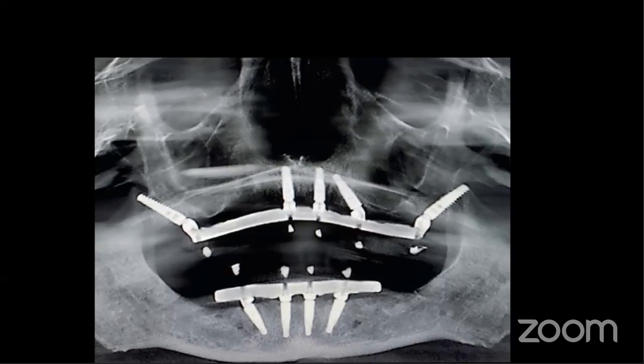And to balance the restoration out, we also went ahead and placed a pterygoid implant on the other side. So now anytime we're doing a pterygoid rescue implant, we'll always give the patient the option and say, we need to place an extra implant on this side. Do you want us to place one on the other side to balance the restoration? And I'd say about 70-30, 70% of patients will say, yes, go ahead and place another one on the other side. And about 30% of the patients will say, no, I don't want to go through the extra surgery. Just place the one on the side that you need it, and don't worry about going to the other area.